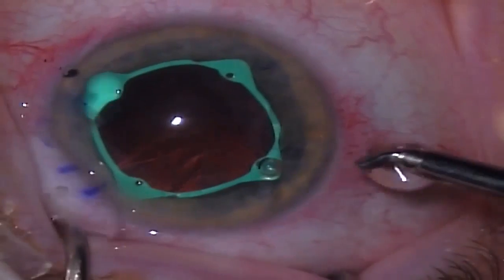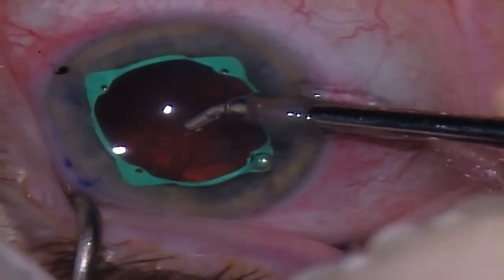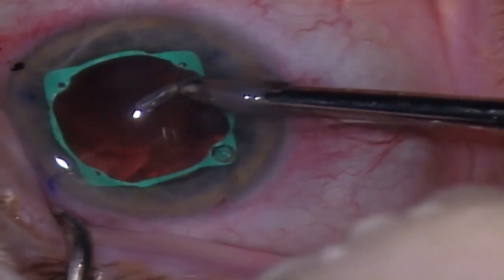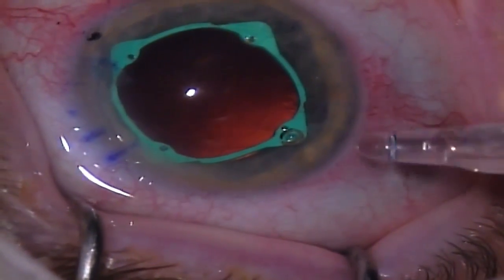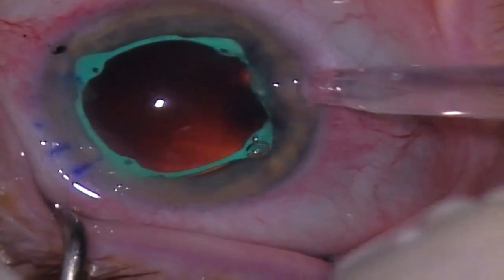Following phacoemulsification, I remove the residual cortex with the irrigation and aspiration device, with the eye ring not interfering with this process at all. Following this, the intraocular lens is injected into the capsular bag.